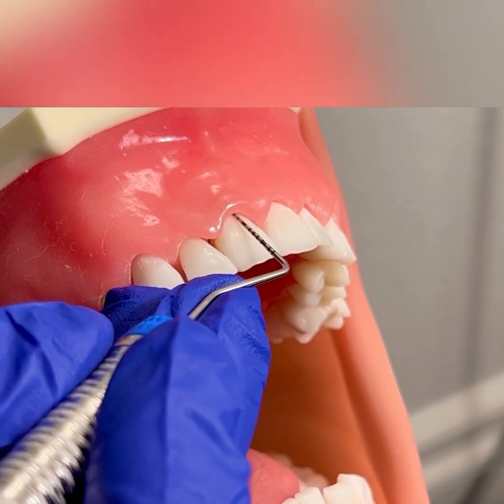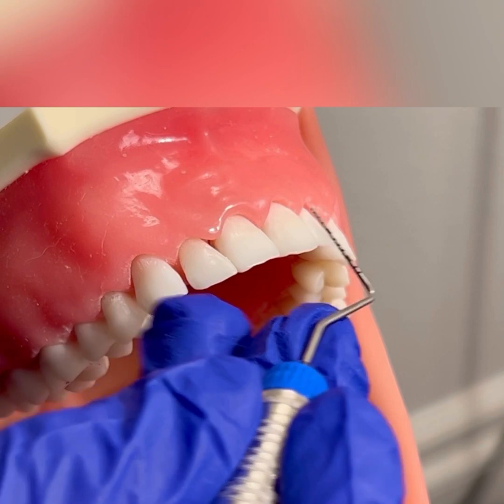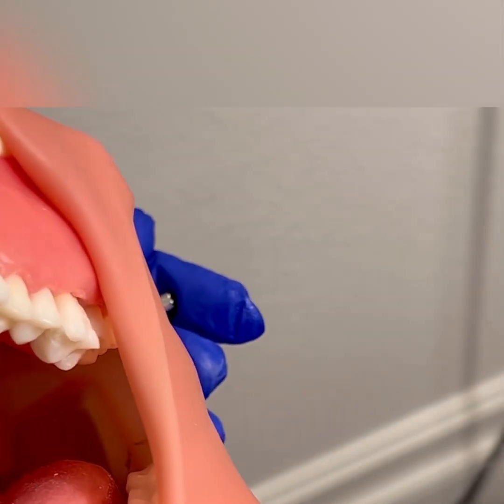You would continue probing across the direct facial all the way to tooth number 16.